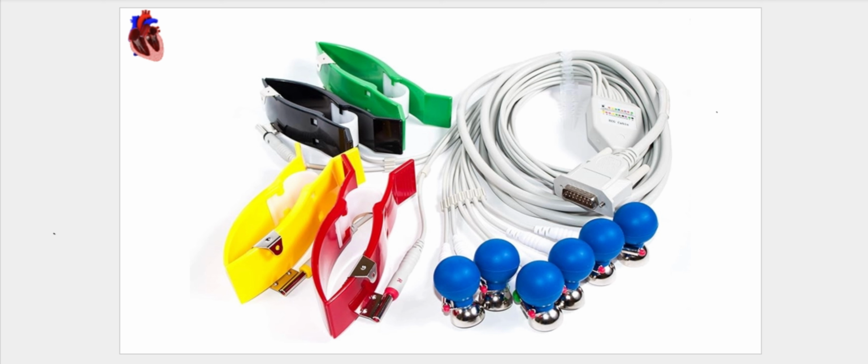Also very important in monitoring the heart function, evaluating some symptoms such as chest pain, palpitation, dizziness, and shortness of breath, to tell us with some specific clarity why patients could be having those symptoms. And also it is very important in that there are some patients who normally receive some implants or pacemakers. So to assess the effectiveness of these therapeutic modalities, or rather things like pacemakers, you can also use ECG.